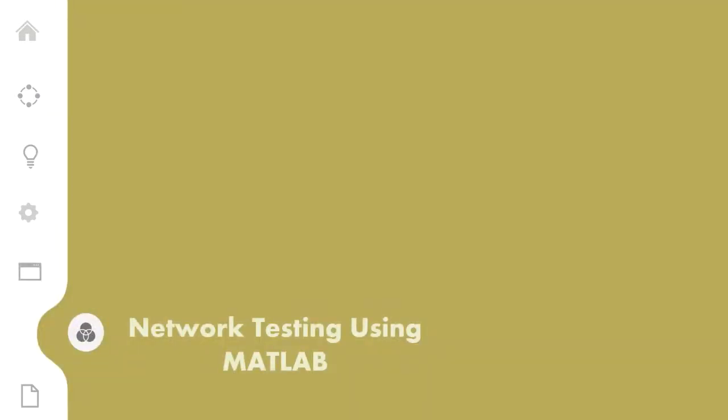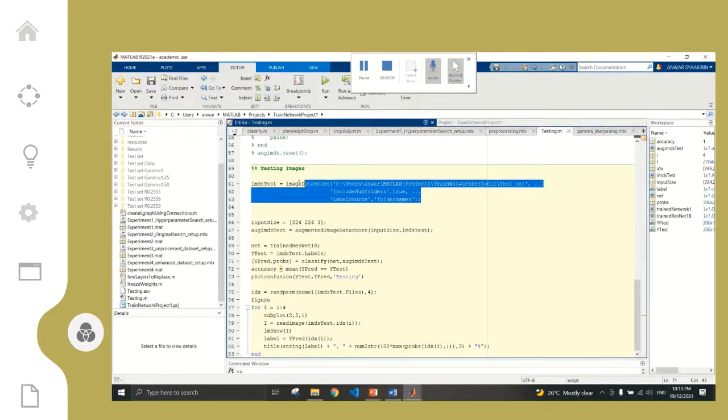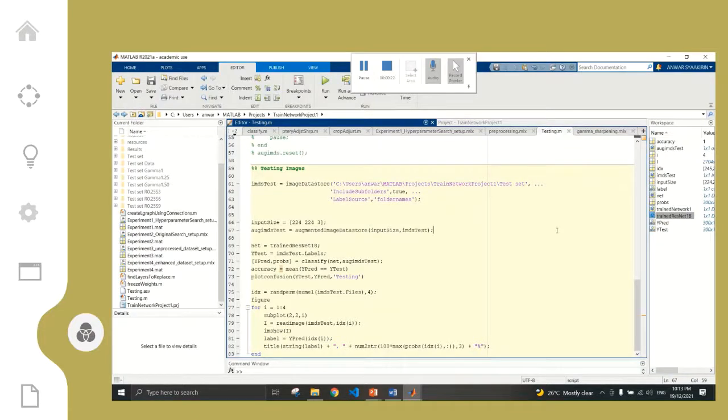Now, we will go to the network testing using MATLAB. From here, I will show the testing process with the MATLAB code. I have prepared a folder consisting of normal and Pterygium images combined. I also have exported the trained ResNet18 into the workspace. Right now, I want to classify all of the images inside the folder. Then, I will take 4 images out of that folder to see the accuracy value of those images that have been classified.